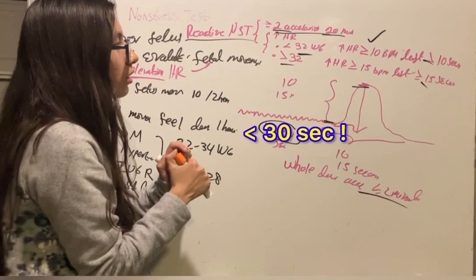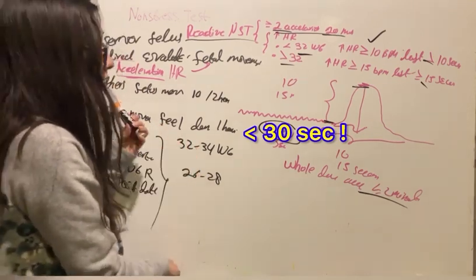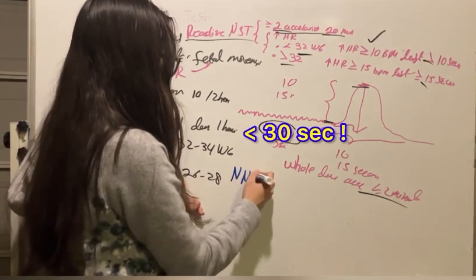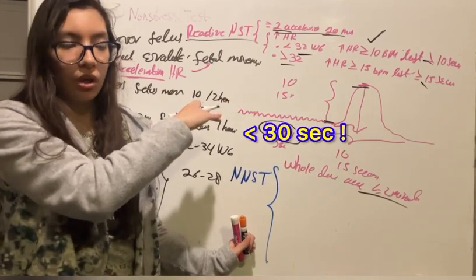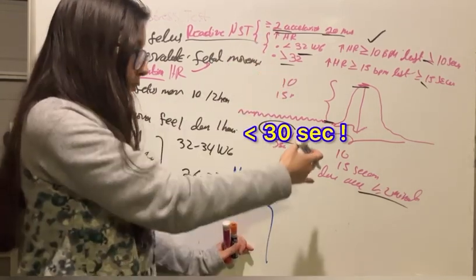In the case of a non-reactive non-stress test, this means that this criteria was not met.